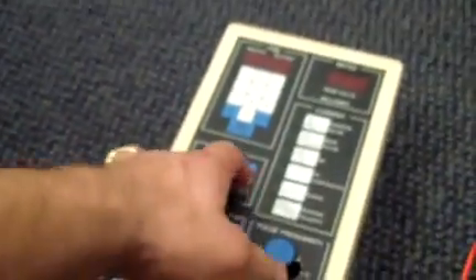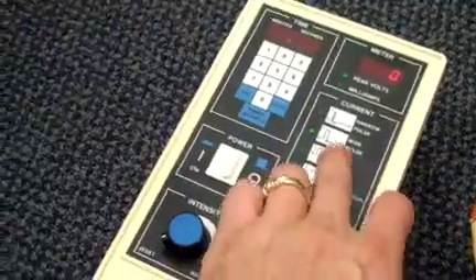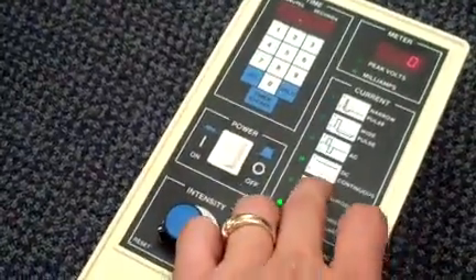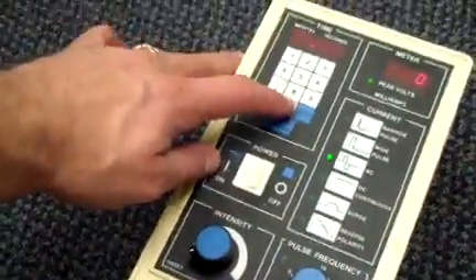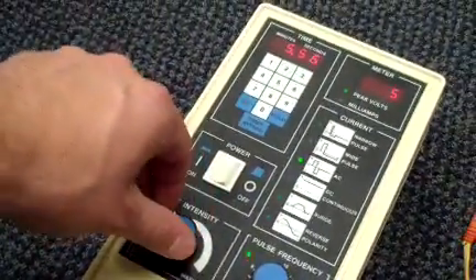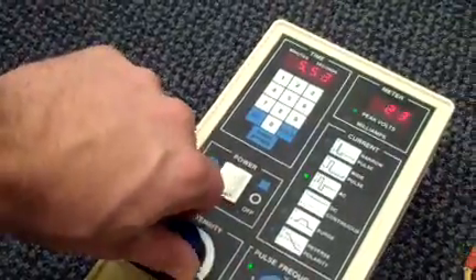It powers on without problem. You can switch to any of the different programs as you can see. The timer sets up and starts, and as you increase the intensity knob it adjusts as well.